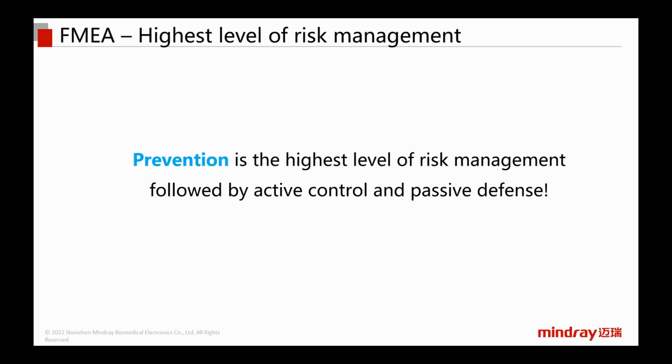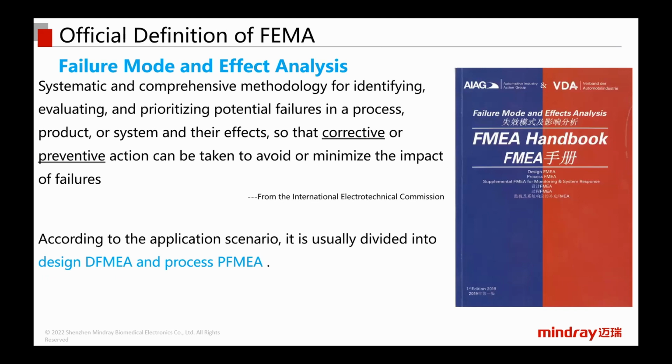And that's exactly the core essence of today's topic, the FMEA analysis. The origin of FMEA analysis, or failure mode and effect analysis, is a systematic methodology constructed from experience of identifying possible risks during industrial production. This handbook gives two approaches of analysis mode. Looking from design perspective, the DFMEA, and from process perspective, the PFMEA. Today, I will introduce mainly the process FMEA as it matches with the medical engineering risk analysis, focusing on the medical device itself.